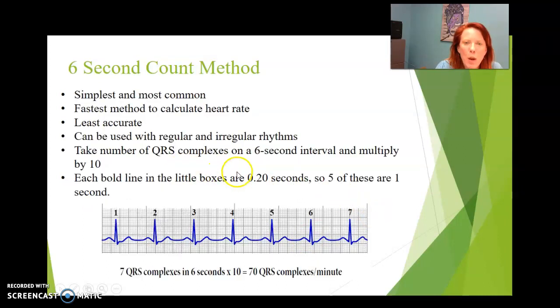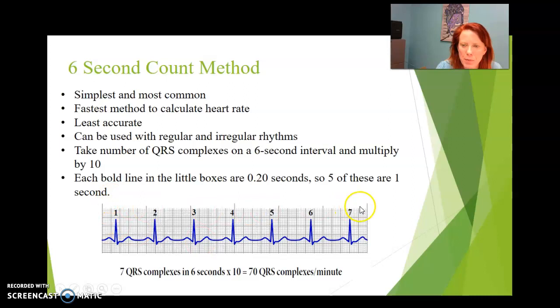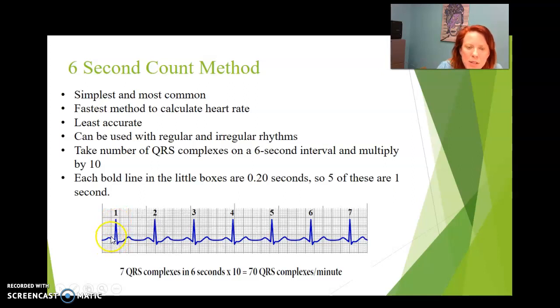Each rhythm strip is a six-second rhythm strip, and this is how I'm going to be giving you all of your rhythm strips. What we essentially do is count the peak — we call it the R2R method because, as we've discussed, this is the P wave, this dot is QRS, and this is the QRS wave. So what we're going to count is R2R as one wave.